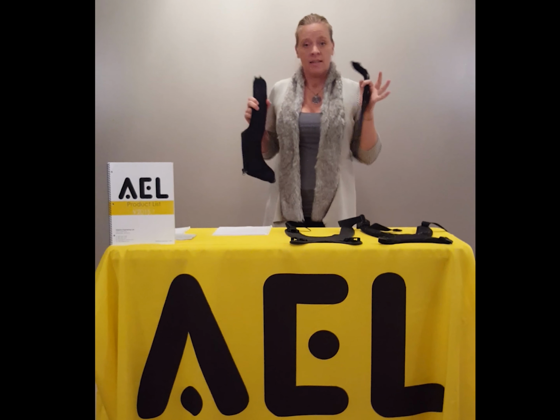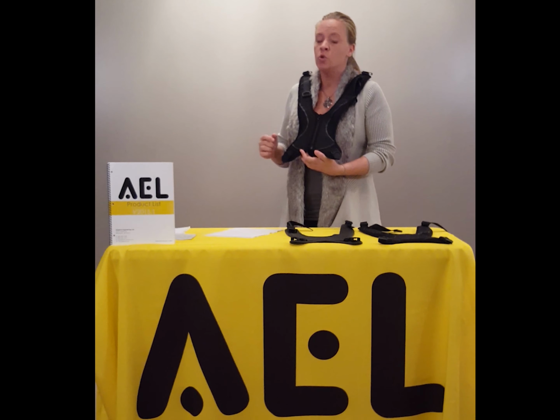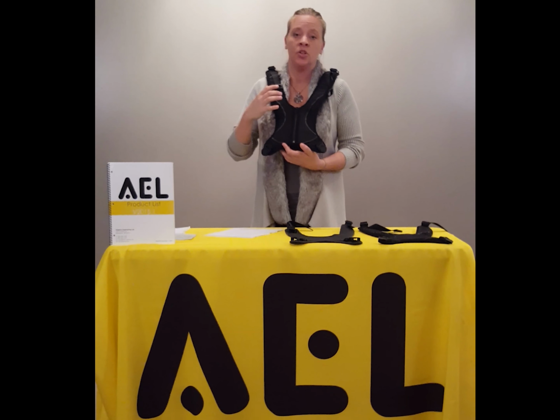But the nice thing about the zippered option, it's easy removal, it's immediate release, and for clients who do have some rotator cuff issues, maybe some shoulder arthritis, maybe they're status post-CVA, they've had a stroke, they don't have the hand strength to work the clasp, the buckles that you see there. It's a very easy to remove type of device.